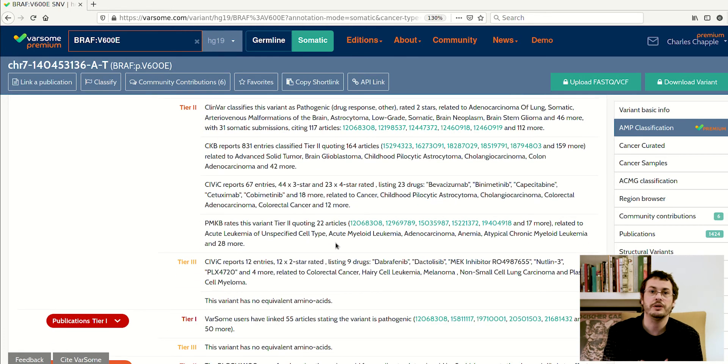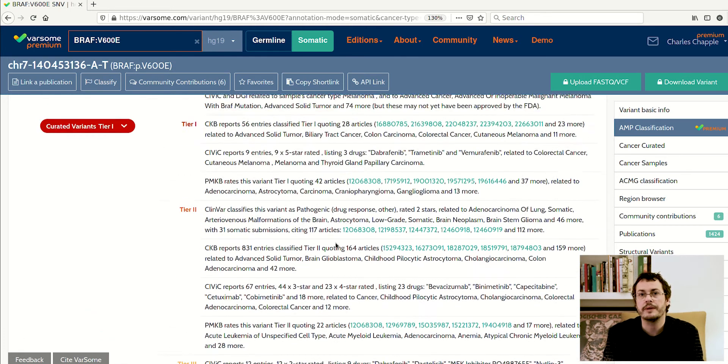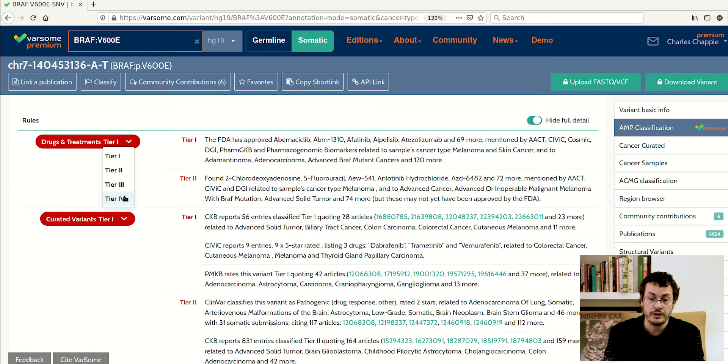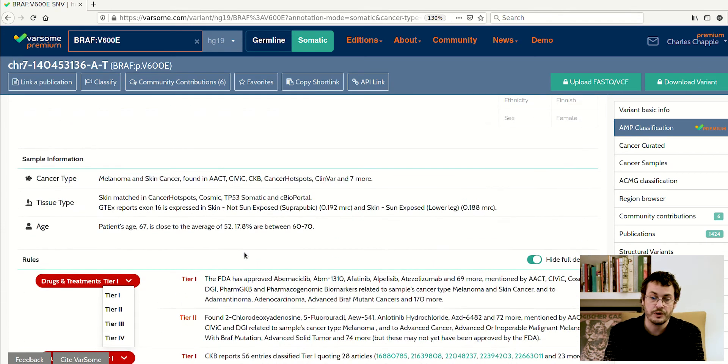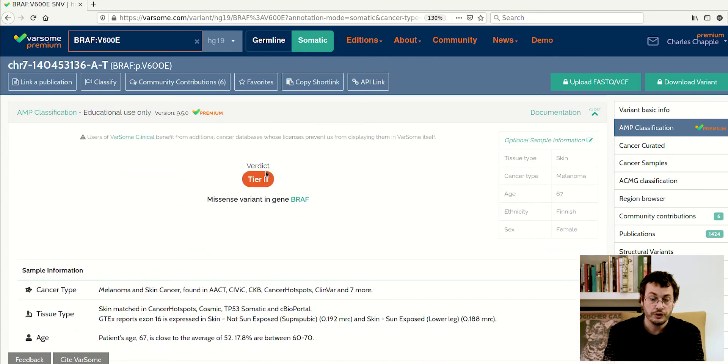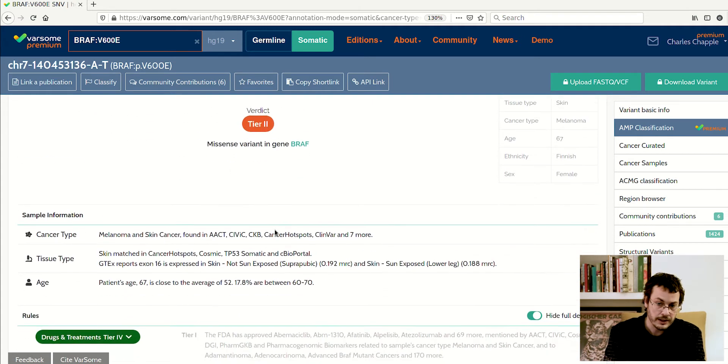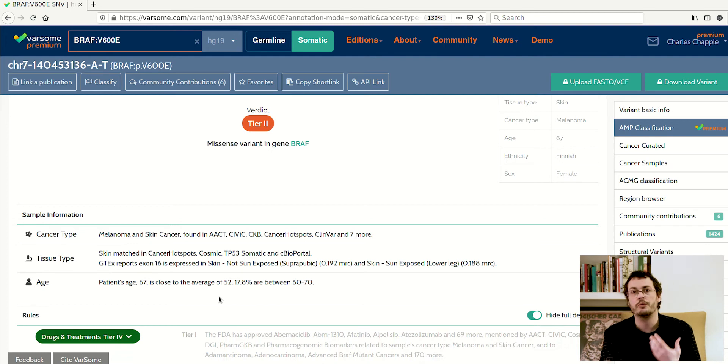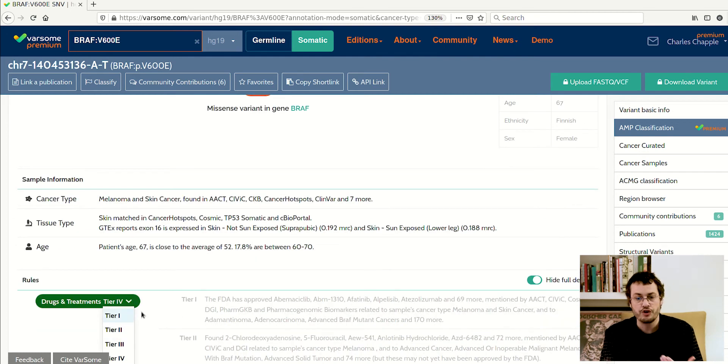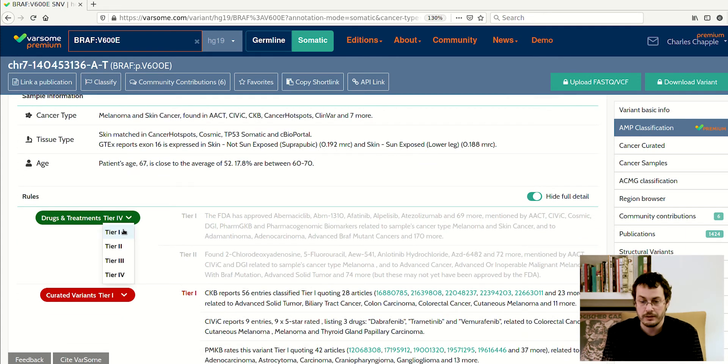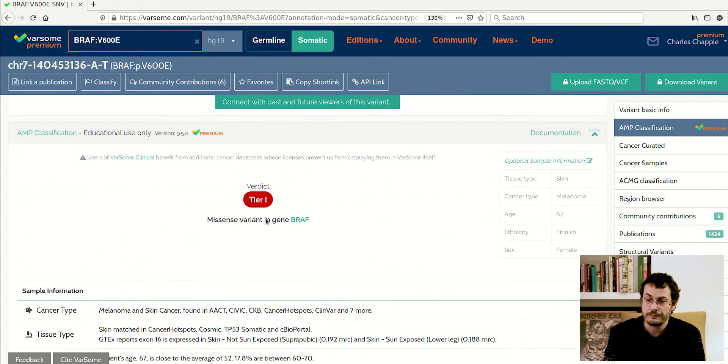Now, if for whatever reason you disagree with one of the annotations or one of the choices we have made, you can change it. And when you do, you'll see here that the verdict is tier one, but if I were to lower the importance, it can go down to tier two or even lower. So if you don't agree with us, you still can change it and see how the verdict would change based on the AMP criteria.